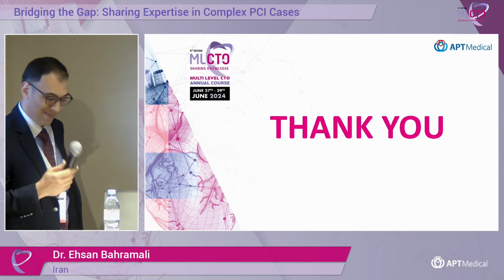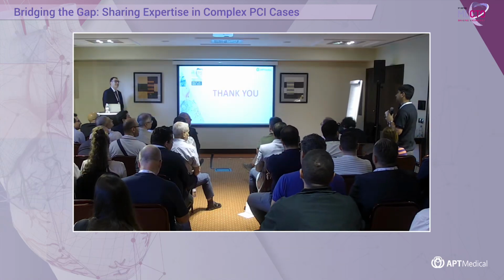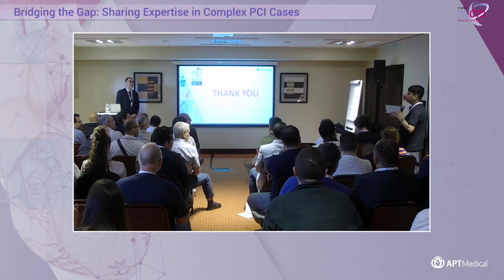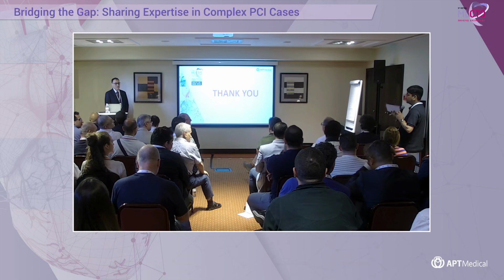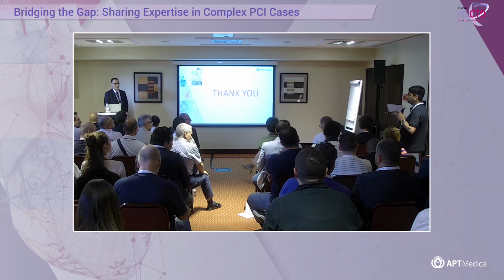Thank you very much. I've got 2 questions. First is about the first case. How many of us would wire a graft which is reasonably flowing? This graft was not totally knocked out, but subsequently post PTCA to LAD, you could see a retrograde filling of the Lima graft. We don't know that Lima still could be the reason of her ischemia and hypotension. So would you consider closing Lima in this case?